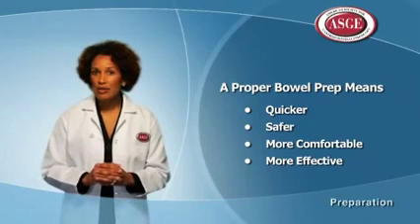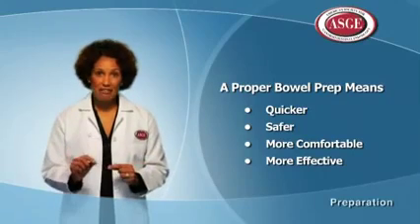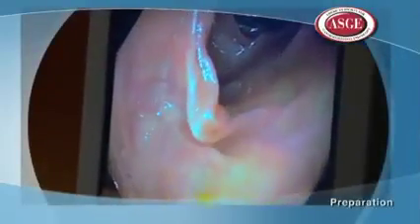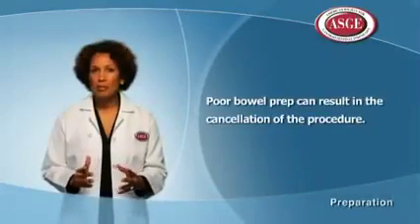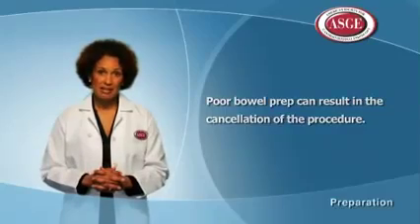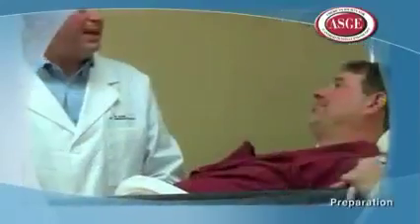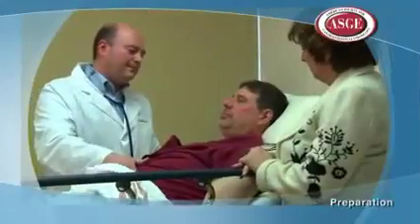A well cleaned out colon is likely to result in a colonoscopy that is quicker, safer, more comfortable, and more effective. A proper bowel prep is very important so that your doctor can clearly see the colon and can identify polyps or other abnormalities. A poor bowel prep where the doctor is unable to see the colon may result in the procedure being canceled. Eating before your colonoscopy could cause serious complications if your doctor doesn't know that you've not followed the diet and bowel prep instructions.